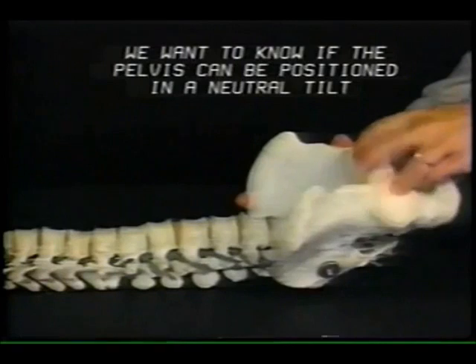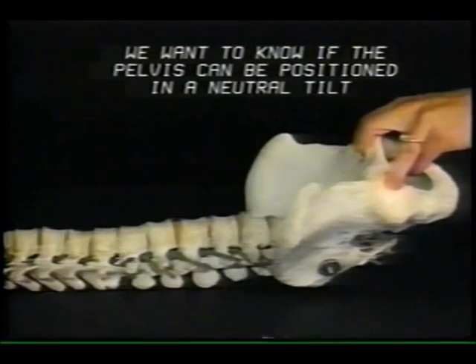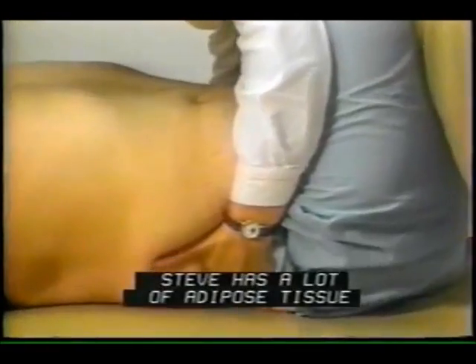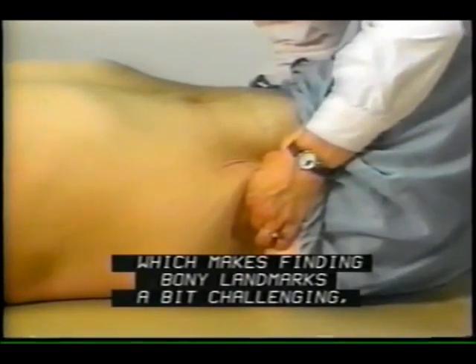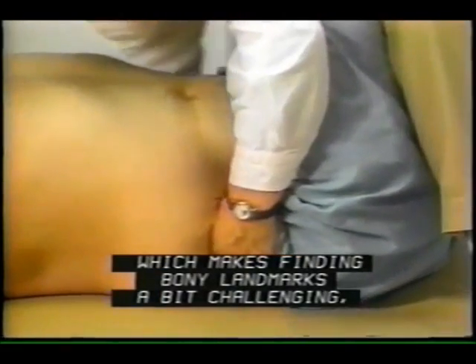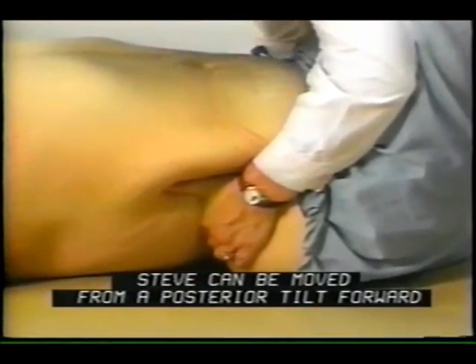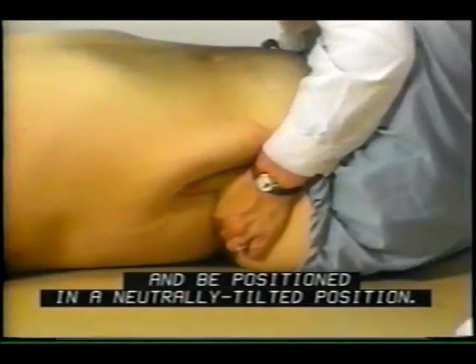We want to know if the pelvis can be positioned in a neutral tilt or even a slightly anteriorly tilted position. Steve has a lot of adipose tissue, which makes finding bony landmarks a bit challenging, but this is real life. Steve can be moved from a posterior tilt forward and be positioned in a neutrally tilted position.